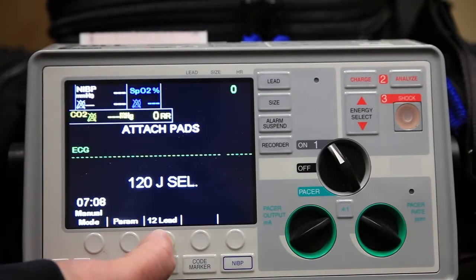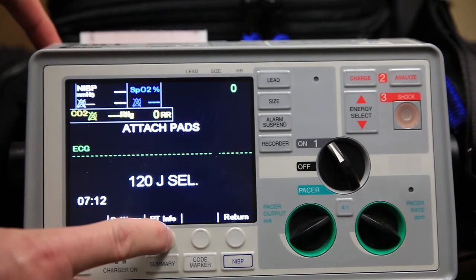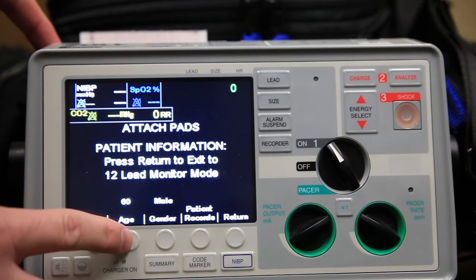On your cardiac monitor, hit the 12-lead button. We will go to Patient Info. There you can change the age, the gender, and that sort of thing.